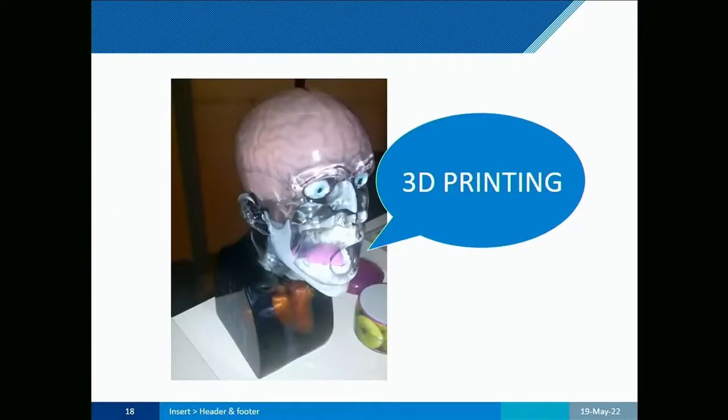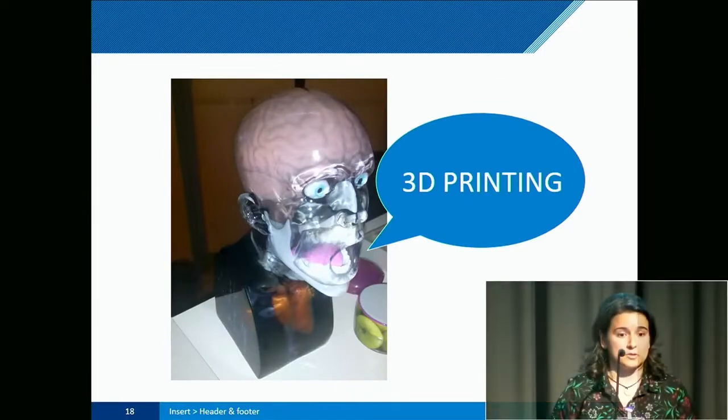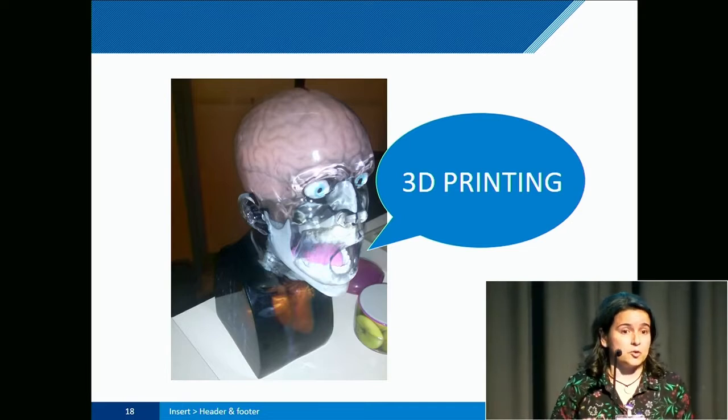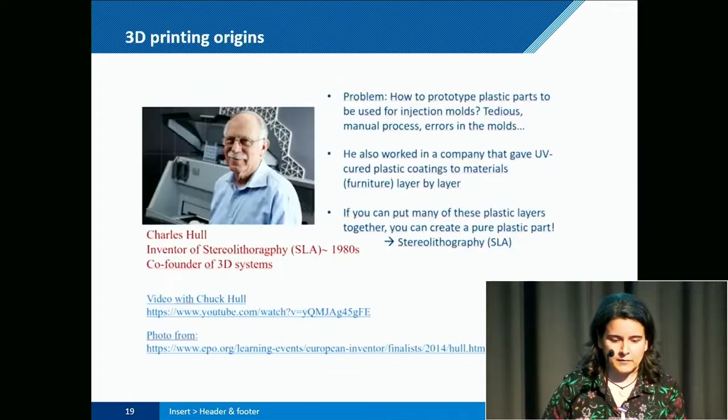So one of the things I investigate is using 3D printing to try to create these test objects that we're going to use instead of the patient, because we cannot scan the patient as many times as we want. And also, having an object that you know exactly the structure and you know the design can help you to try to see how image quality is going to degrade or improve depending on what you select on the scanner.